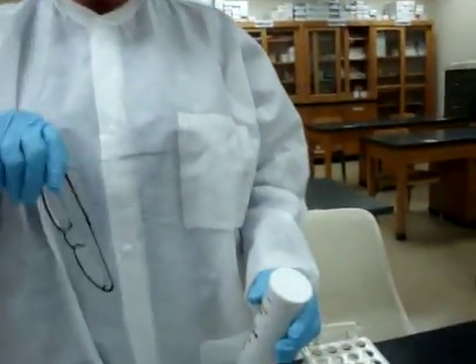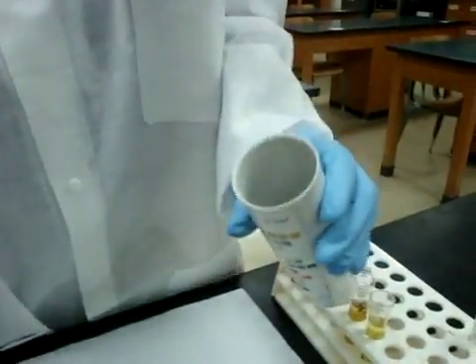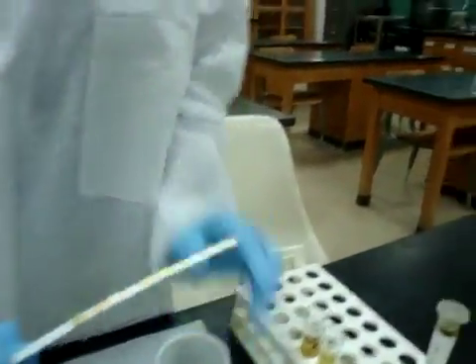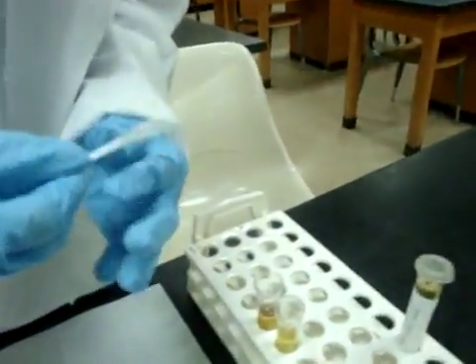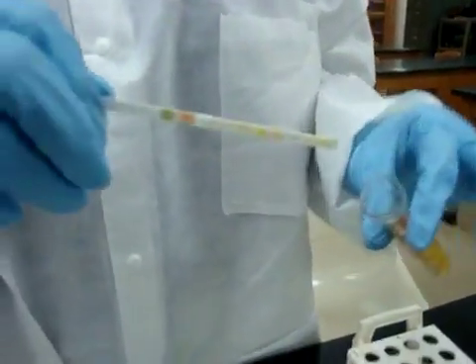Okay, next we're going to read our positive quality control. The first thing we do is we pick up the can of our dipsticks. We remove a dipstick, put the top back on the container, pick up our urine again. Let's put this here so we can blot off the rest of our liquid.